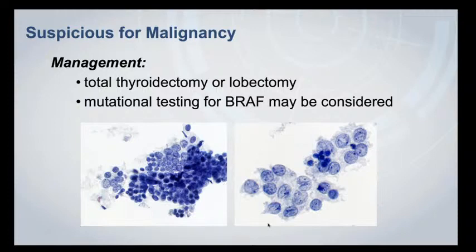We don't do that terribly often here in my own laboratory, but every now and then we do consider it, and we will do it occasionally when it might be critical clinically to get a more definitive diagnosis, if possible, and that's where a positive BRAF might be helpful. If the BRAF is positive, you can consider calling it just frankly malignant.